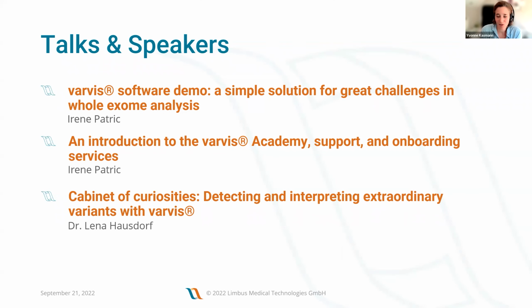So this session is basically divided in 3 parts. We will start with a software demo after the introduction, where my colleague Irene will show you the software in detail and some nice use cases in the software. We then have an introduction to the additional services we're offering, like training programs, support, onboarding services, validation, and so on, also presented by Irene.